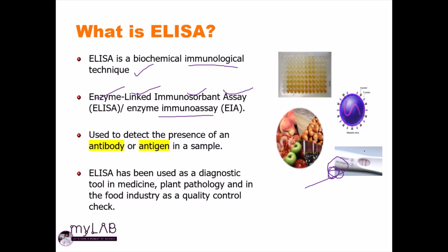Let's say it's a bacterial or a viral antigen, and then we are expecting to find an antibody within the patient's serum. After that, there will also be conjugated moieties and molecules that will again bind to our analyte of choice.